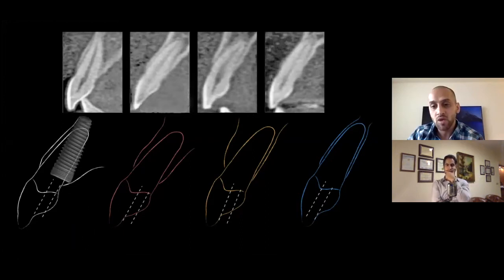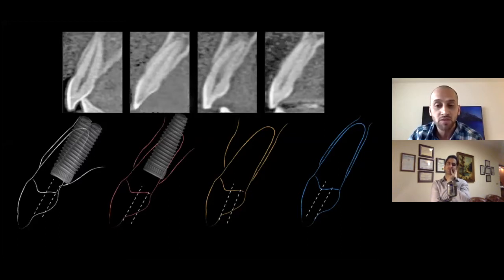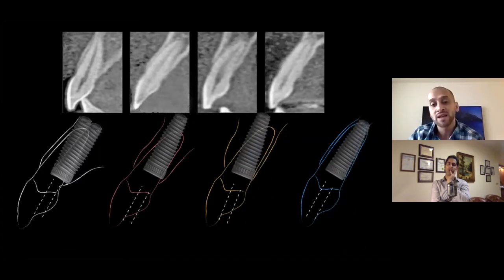For example, we can place an implant in this fashion. Some people place the implant in the palatal plate and try to engage it to get screw retention, but then you have this huge buccal cantilever. For class twos, you may be able to get away with placing the implant this way for screw retention, but then our primary stability may be questionable because you don't have so much wall to implant contact. Class three, same situation. And class four, you have no choice but to do a cement retained restoration because there's really no way to move that implant, because the bony housing is very limited.